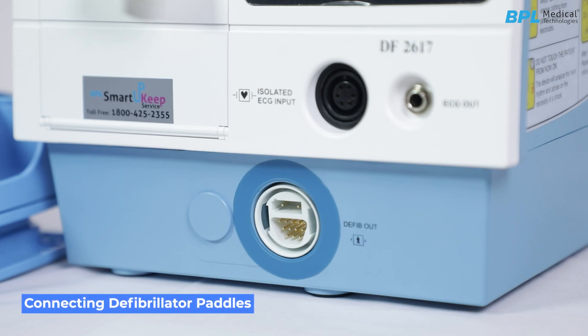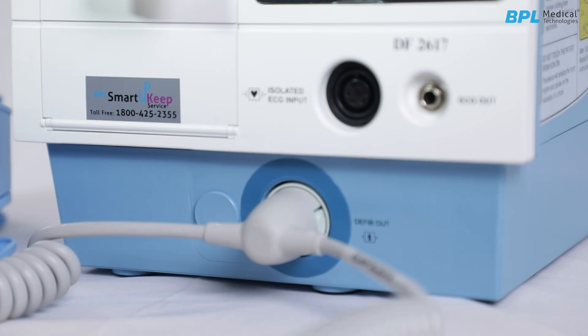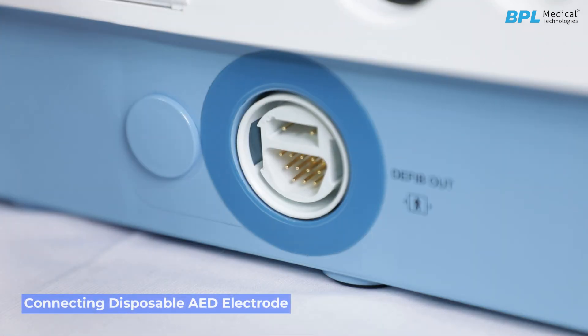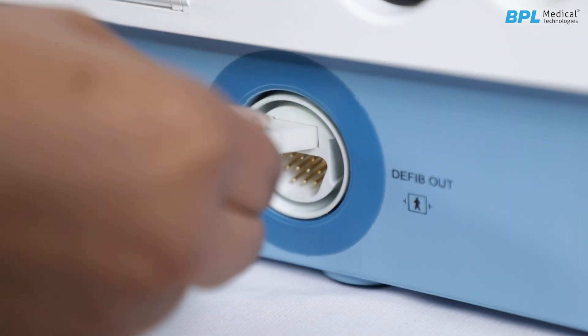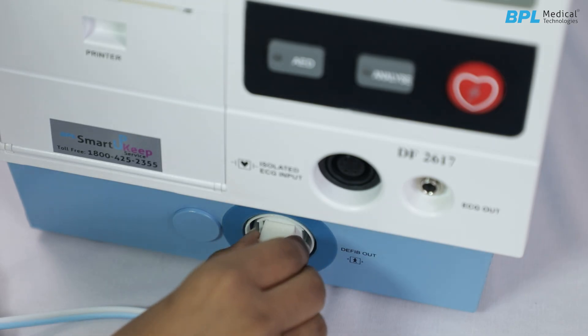Connecting defibrillator paddles: Insert the paddles into the holder on the defibrillator unit. Align and insert the plug into the output socket at the unit's front bottom panel. Connecting the disposable AED electrode: Slide the connector shutter to access the AED connector. Insert the disposable electrode connector into the holders on the defibrillator unit. The connector should lock into the socket. To remove the plug, hold and press the latch on the plug and pull back.